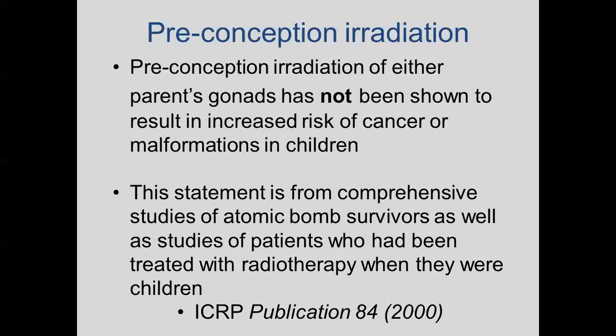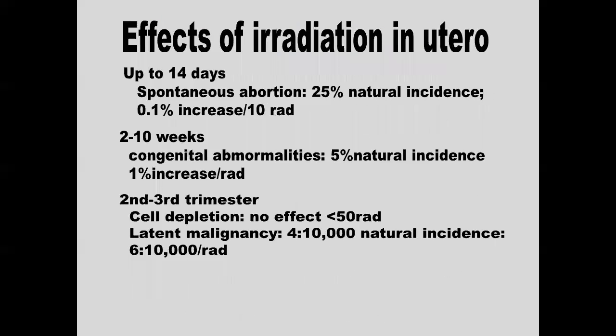And this is an interesting thing, because the most often thing I hear when I yell at people for coming into the cath lab without lead on is, I'm not having kids anymore. That is the first thing. Anesthesiologists love to say that. I'm not having kids anymore. That's not even a consideration. You know, if you're pregnant, then it's a consideration.